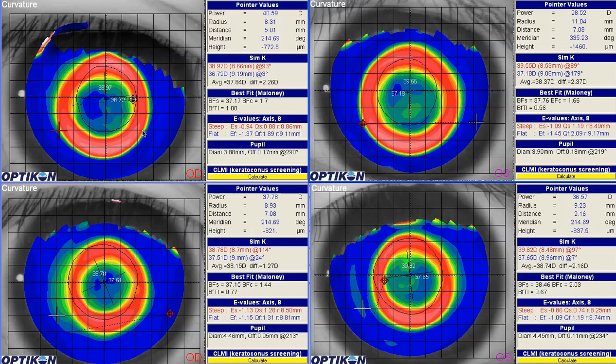With the second set, we had pushed the OZ and IC out about a millimeter, and we gained just around a half, maybe a little bit over a half millimeter diameter in treatment zone. So we're getting more of the pupil inside the treatment zone, but the patient still got glare. So what else can we do to help the patient?